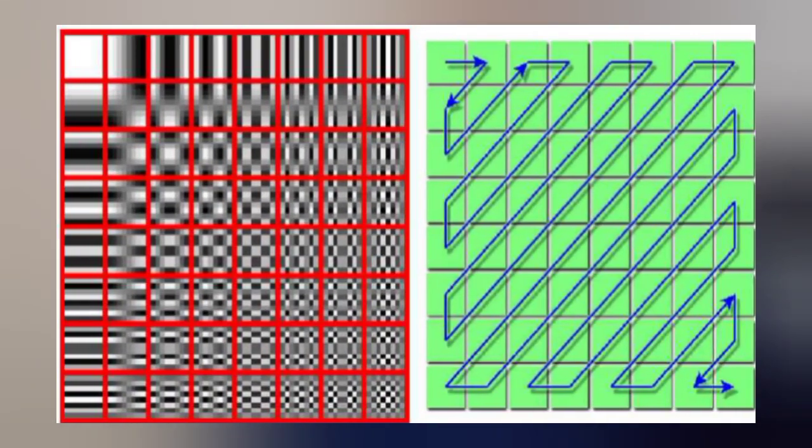Now remember, in the other lecture, we talked about the matrix in the scan converter, the memory. So physically, the digital scan converter is a computer memory chip that consists of a matrix of squares, like you have in the chessboard. Each square in that matrix is called a pixel or an address location. Each pixel or address location is used to store the echo data from the tissue interface occurring at that location.